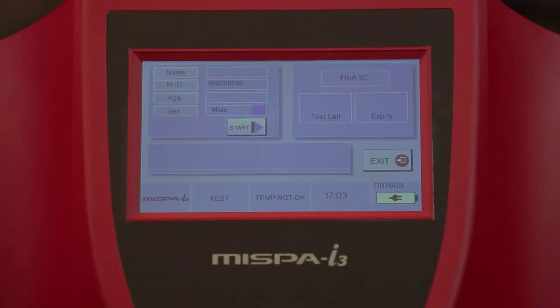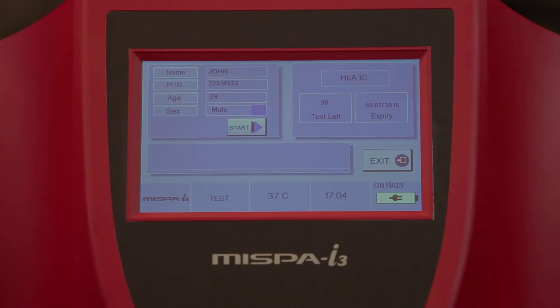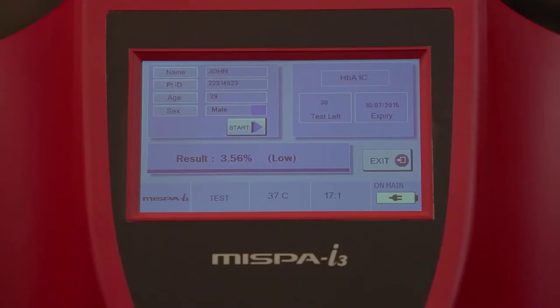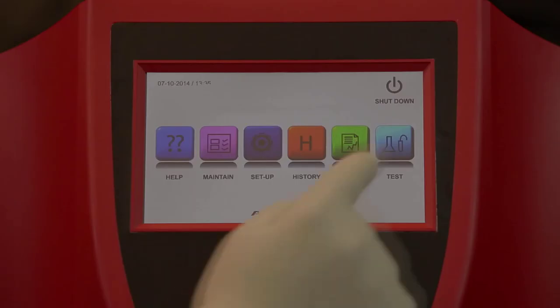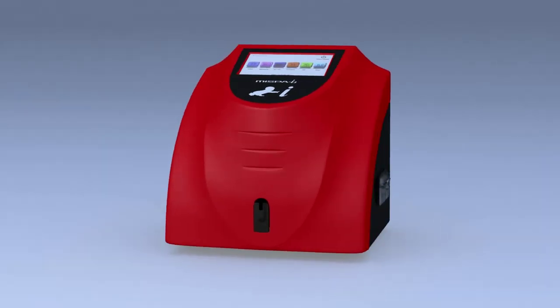The analyzer will read the barcode label on the cartridge and display the corresponding test name with details. Select OK to proceed. Enter patient demographic data and select Start to run the test. Status updates along with a progress bar will be displayed on the screen. Once the measurement is completed, the calculated result will be printed and displayed on the screen. The carriage comes out with the used cartridge. Remove the cartridge and select Continue to proceed to the next test.